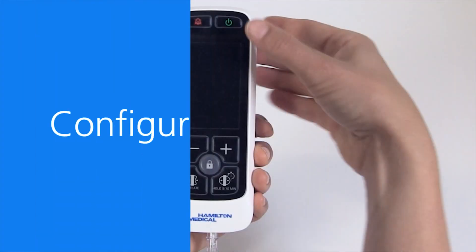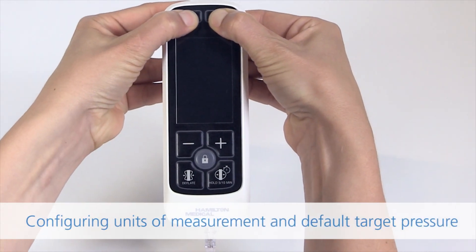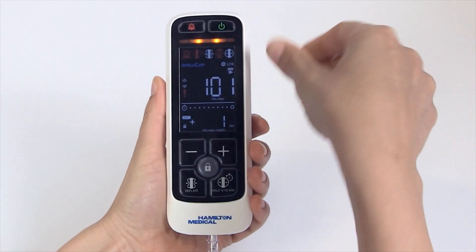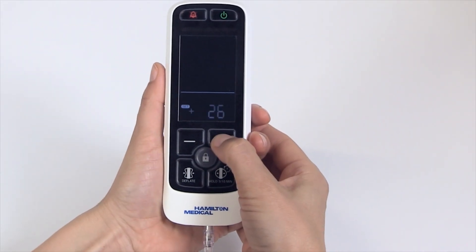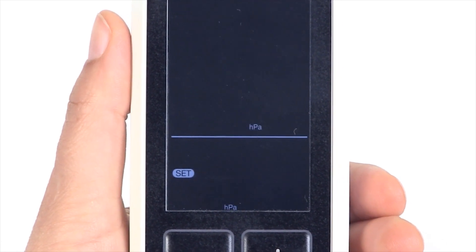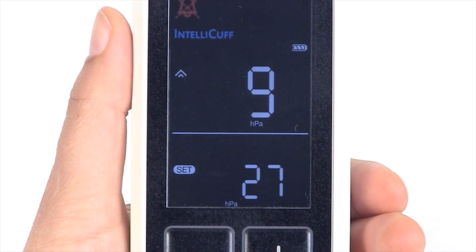Configuration. Configuring units of measurement and default target pressure. Simultaneously long press the power on/off and alarm silence buttons to start the device in configuration mode. Use the increase or decrease button to change the default target pressure. The unit stops blinking and cycles to unit settings. Use the increase or decrease button to move left or right to select the desired unit: hectopascal, millibar, or centimetres of water.